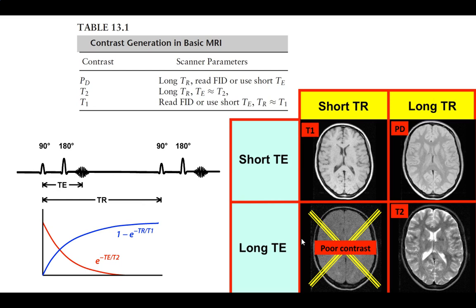So what we want to talk about here, there's actually a whole bunch of different weightings that are out there. The most commonly known weightings have to do with how I measure the two major time constants, T1 and T2, and how I do a proton density weighting. Again, I added an extra slide, that's why I have to re-download them. That gives a better image of why this is the case.